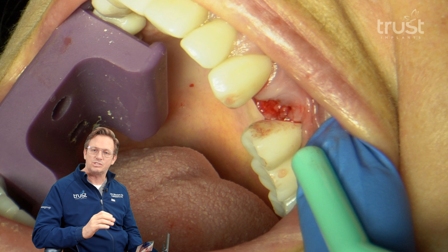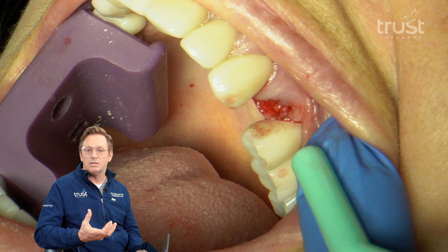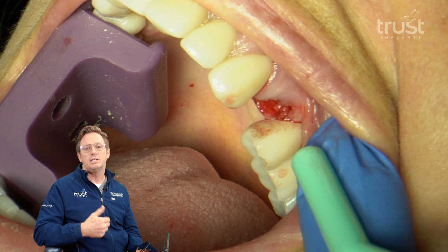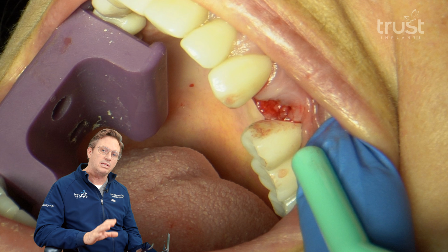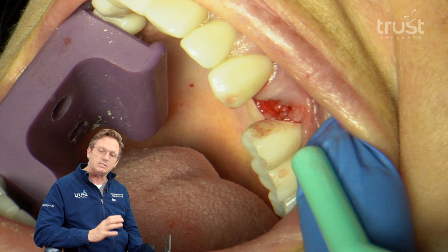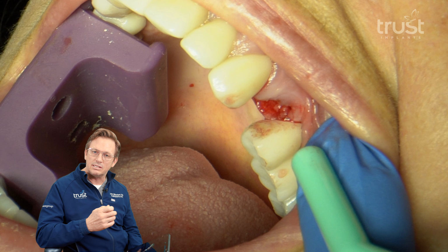In that process, because you're looking at a defect in the bone, and in this case it was a bifurcated bicuspid, you have to choose: am I going to go to the buccal or the lingual in my osteotomy? In this case I went slightly lingual because I want my access hole or the screw to be placed lingual.